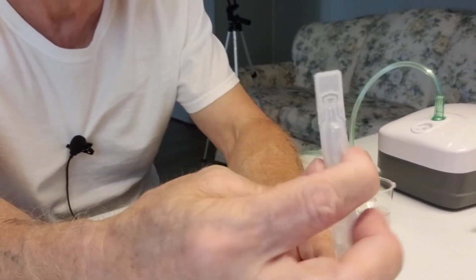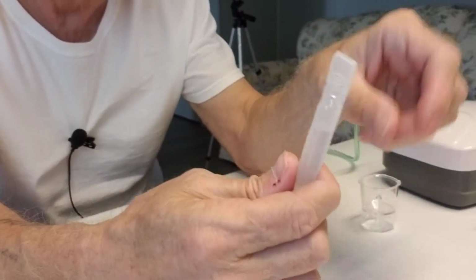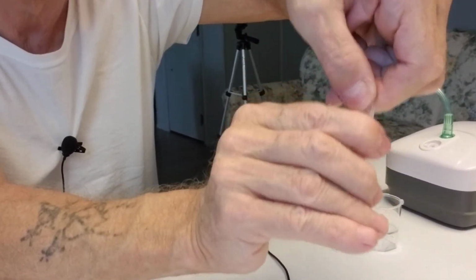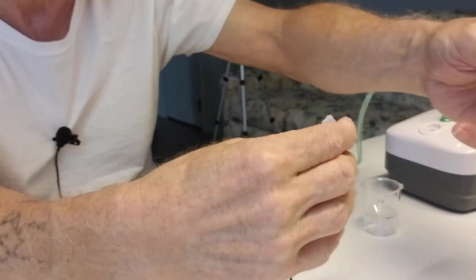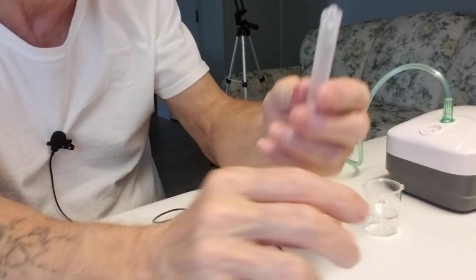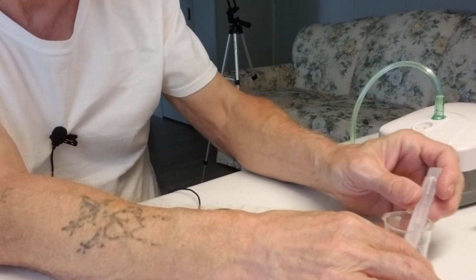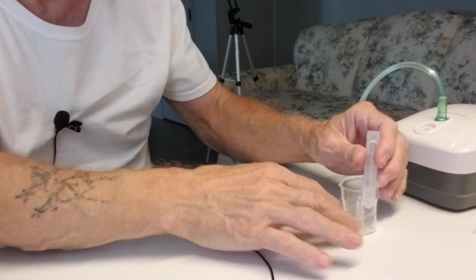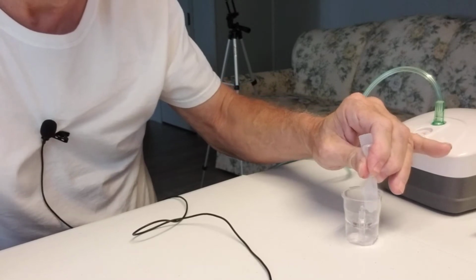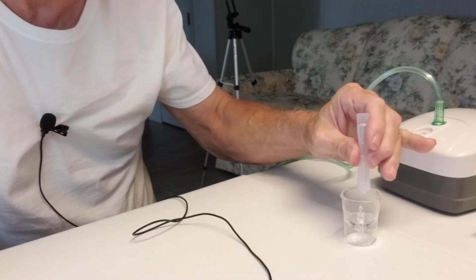You see the top here. The top and the bottom look kind of similar, except for the top is larger. You'll grab this here. You just simply twist. This part pops off. And then there's a small opening here. Then you're gonna take your medication. You simply put this to the bottom. Move this back and simply squeeze your medication a couple times to get all of the liquid into the container.